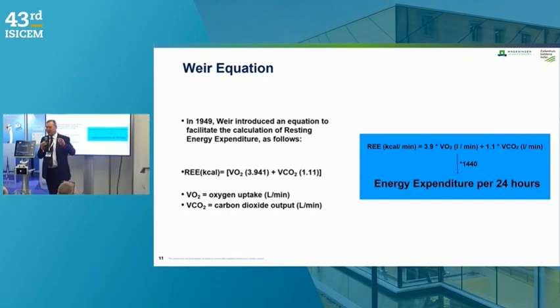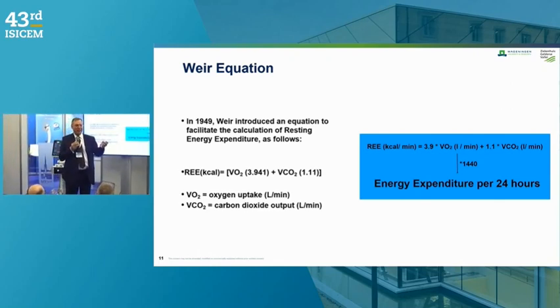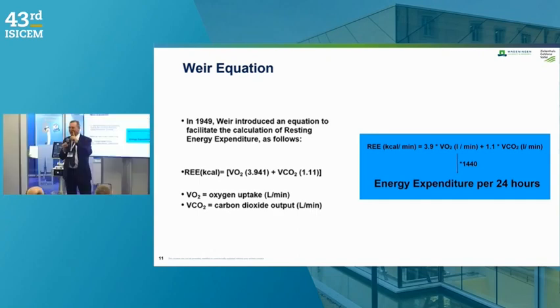CO2 production. So some mechanical ventilators in your ICU have VCO2 available in the device. So that can also help you to predict energy expenditure. Then it's VCO2 times 8.2, that's 24 hours kcals, but then you assume a normal respiratory quotient because you don't have the VO2.